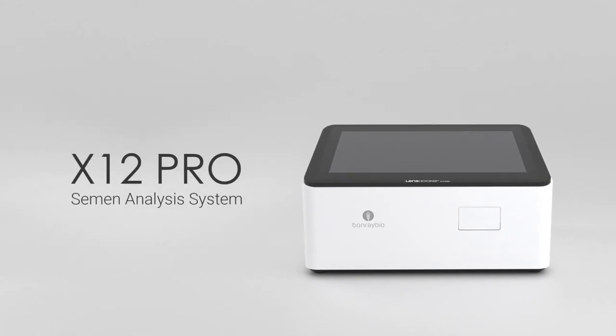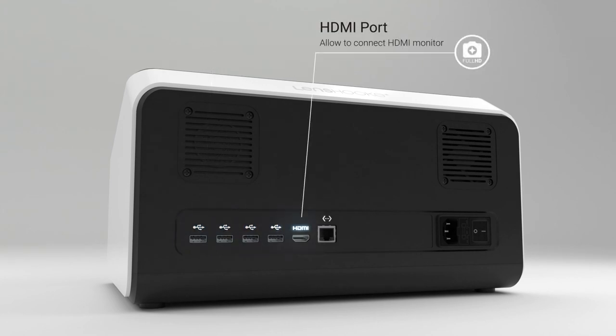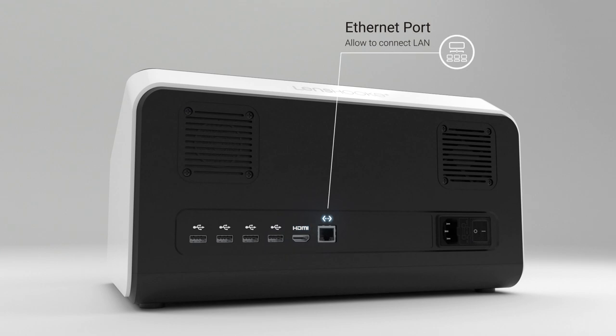Lenshook X12 Pro supports four USB ports, one HDMI port and one Ethernet port to allow you to connect the barcode scanner, HD monitor and the LAN.